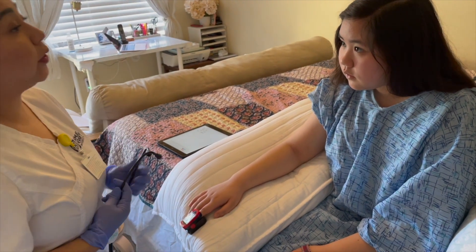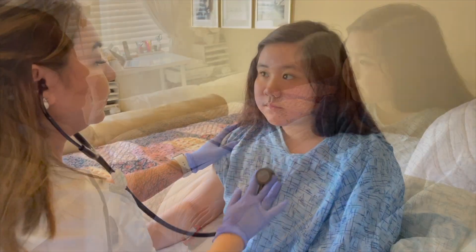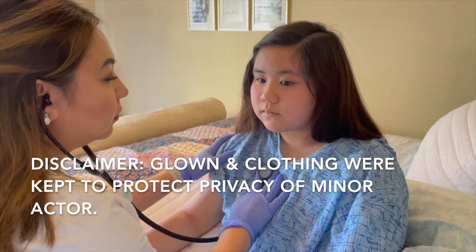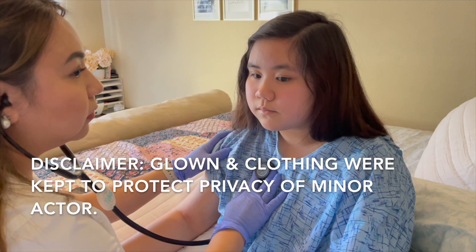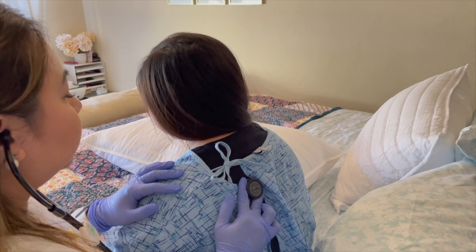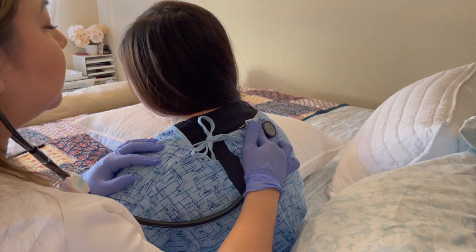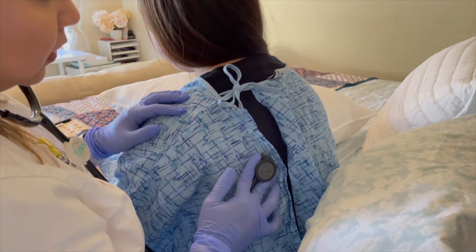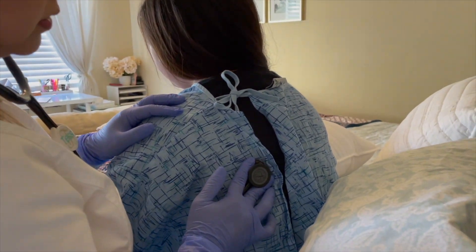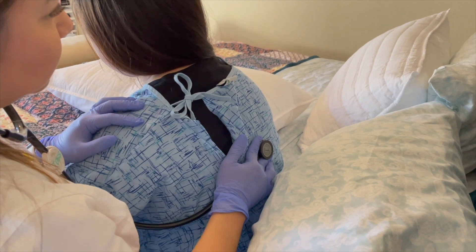While we're at it, I'm going to listen to your heart and your lungs. Place the stethoscope in appropriate areas, both front and back of the patient. Listen to all lobes for both inspiration and exhalation. As much as possible, never auscultate over clothing or the gown. Observe rate, rhythm, and depth, and document the results.